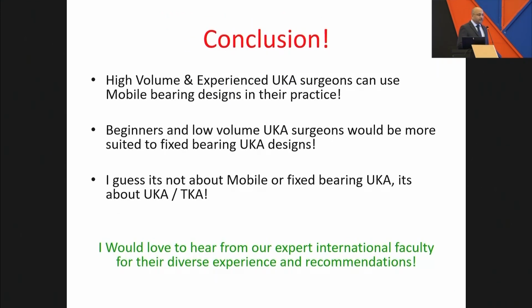So, to conclude, what I thought is high volume and experienced UKA surgeons can use mobile bearing design, and it's just like when you get bored doing the same thing again and again and you are itching yourself, let's do something different and glamorous. So maybe people who are doing it more and more can try this a little more glamorous design because they are more confident, more fluent, and doing it more. So they can shift their practice or balance their practice between the two different design concepts.